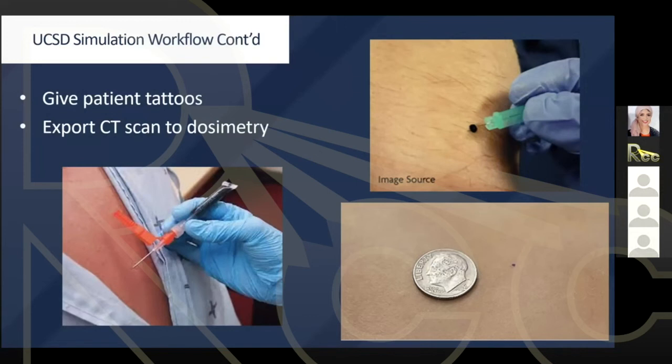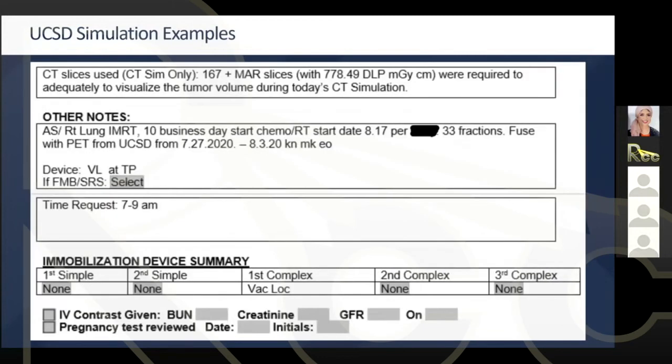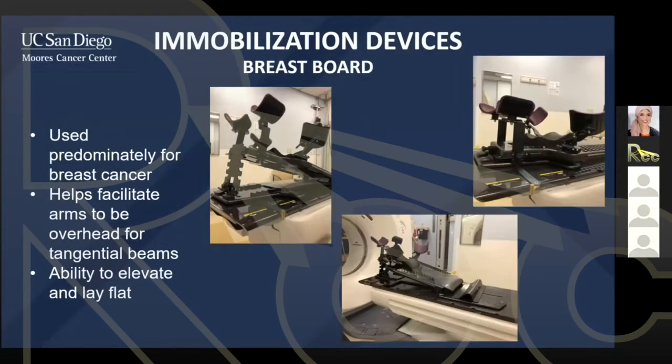Okay, I have many questions regarding the adjustment of the breastboard. I need the picture again, and when to make it flat, and when to use different angulation. I will collect the questions from our colleagues, so we can answer. Ryan, now the breastboard angles for everybody. Yes. Where I work, we only use two different angles. One is at this elevated position here, which is 12.5 degrees, and the other one is just completely flat.